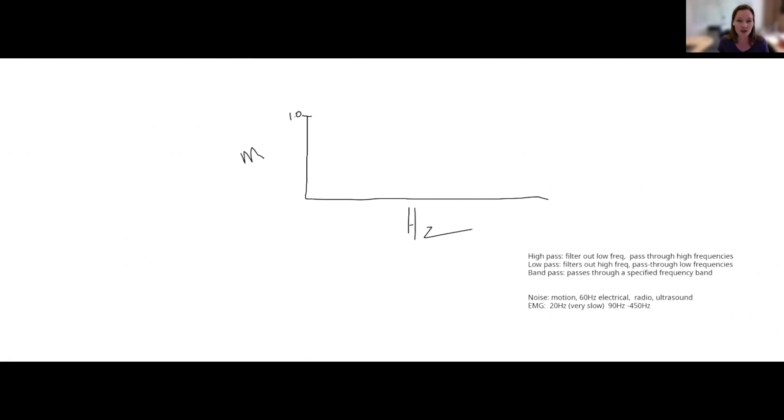With a perfect filter, you'd basically say, I'm interested in frequencies above 60 hertz, maybe, right? Above that frequency, I don't want to filter anything out, so I'm keeping it all in. And below that frequency, I completely cut it out so that it goes down to zero. So it would be like a perfect square wave.